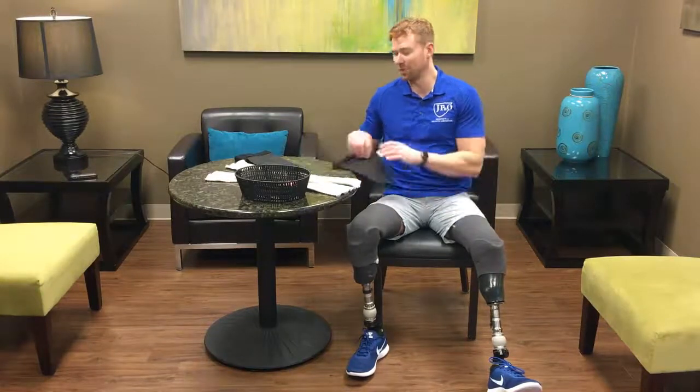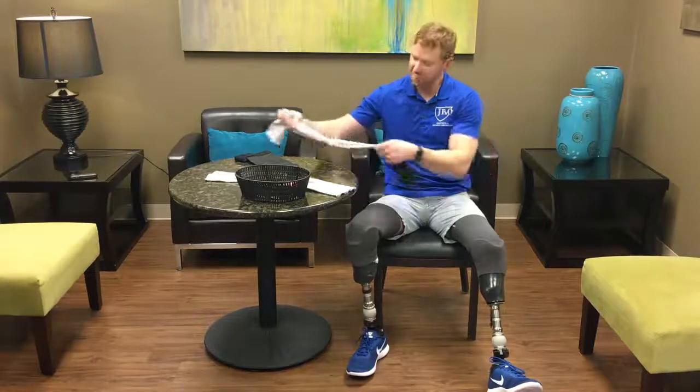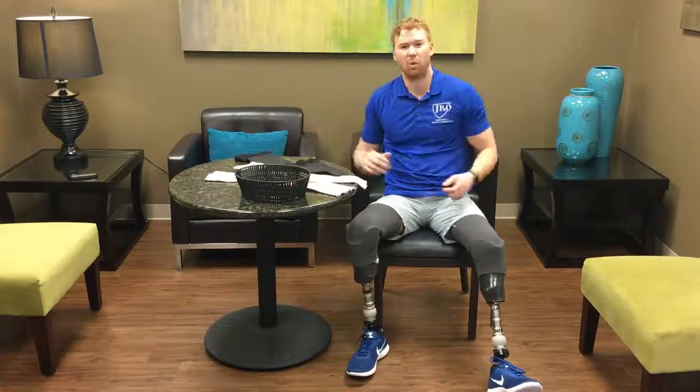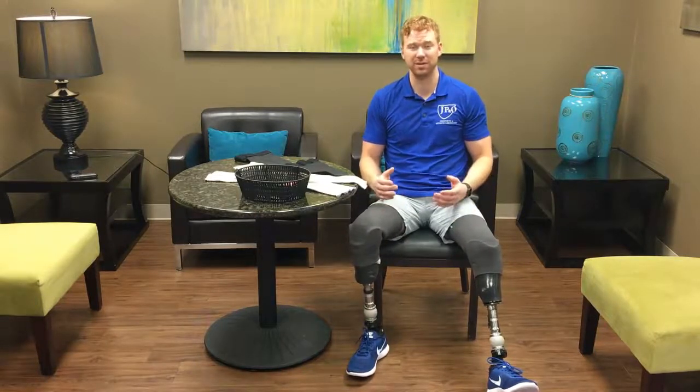Today's topic will cover shrinker socks, what they are, and why we use them. So first, why do we use a shrinker sock? Well, a shrinker sock is used for multiple reasons.